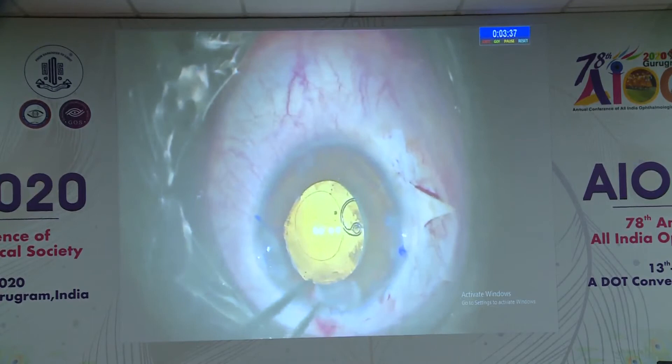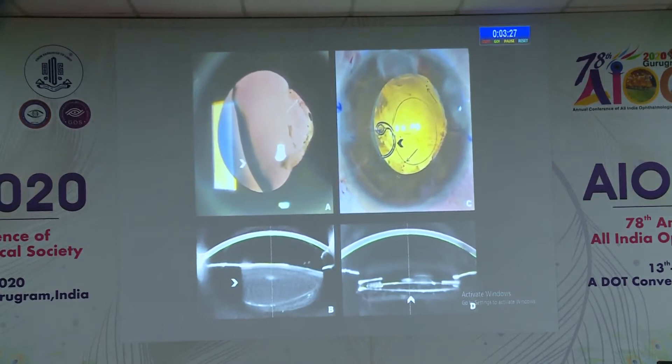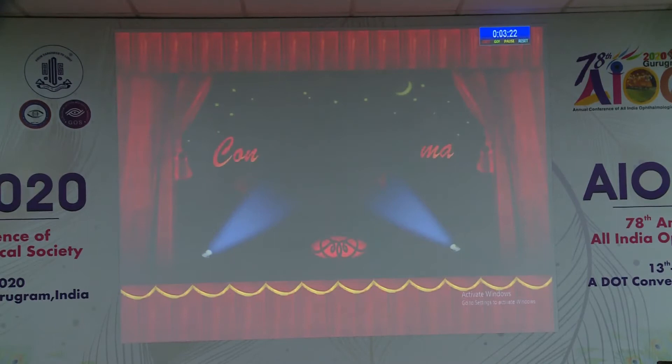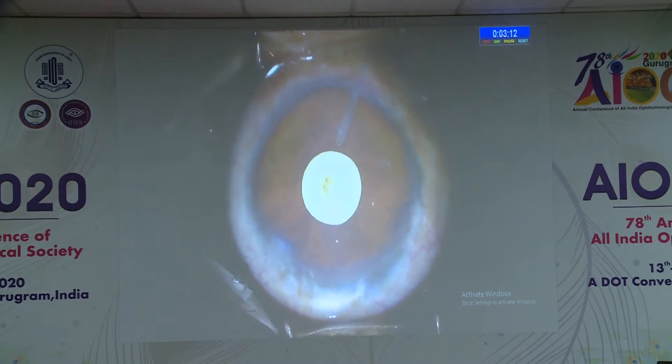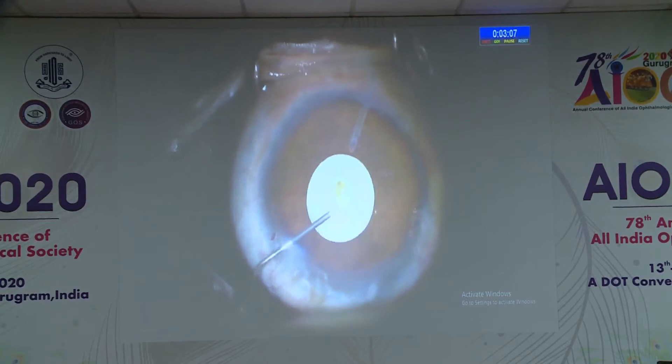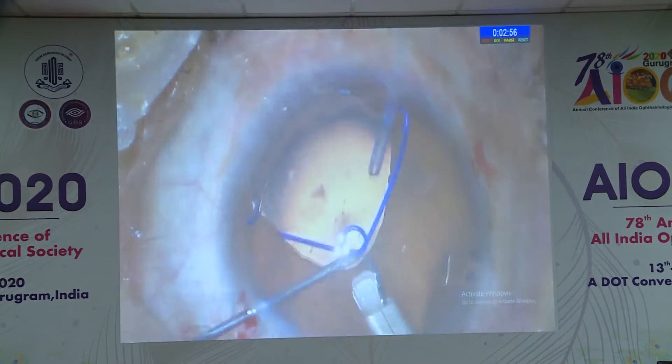Here we are implanting a toric IOL. The final picture looks excellent - you can see just before and after, excellent pictures on both sides. Then comes a congenital glaucoma child referred to us with visually significant cataract. You can see the long tube, and because the pupil was small we used a Malusine ring to dilate it further - the cataract was in the visual axis.